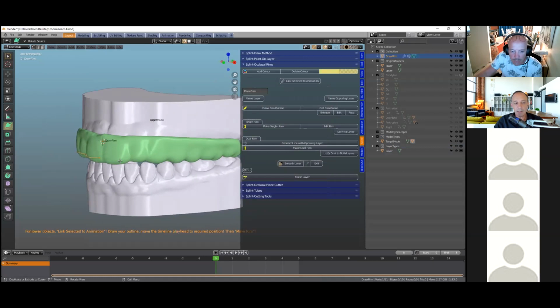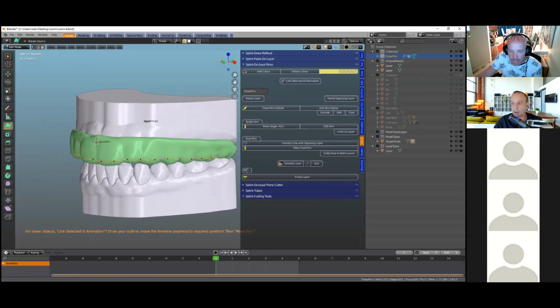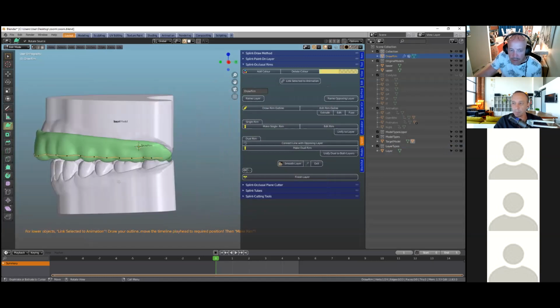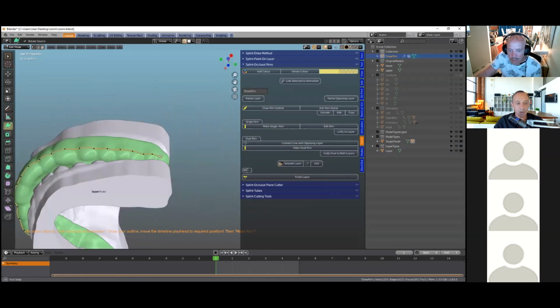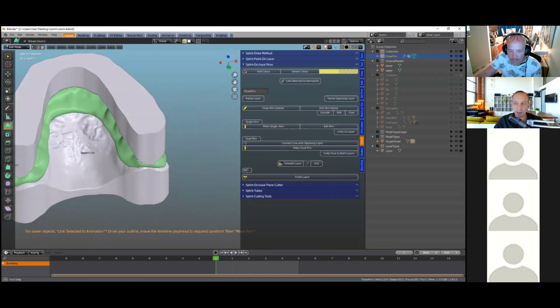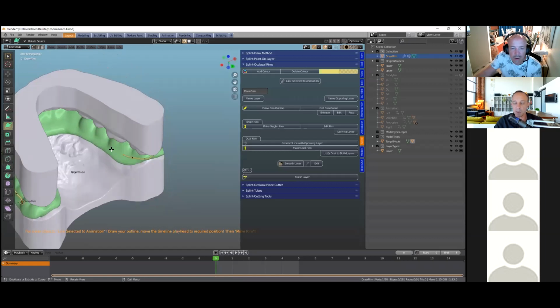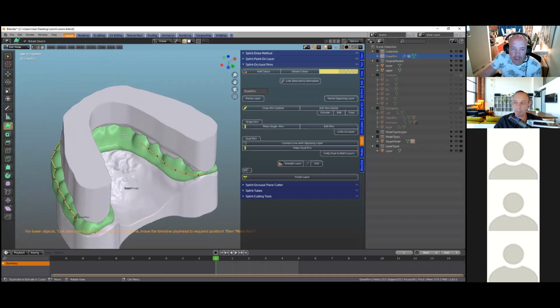Does this extrusion happen in a vertical direction, up or down? Oh yeah, because with the lower, sometimes you don't see it. So it's pulling in the downwards direction. Oh, that's when we actually do the rim.